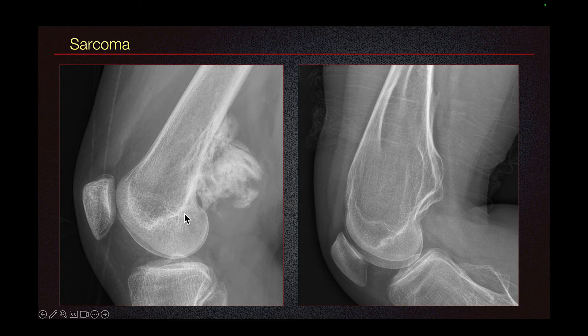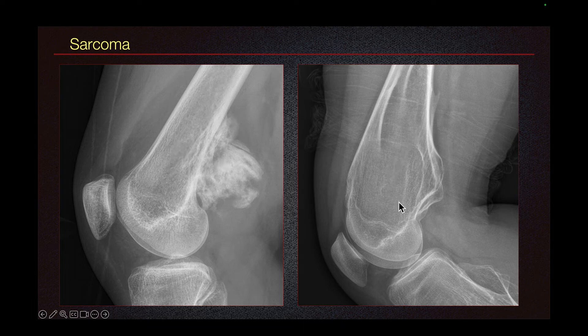Here on the left we have a case of a sarcoma — specifically a paraosteal osteosarcoma. We can see that the cortex and the medullary cavity is not continuous, as compared to the osteochondroma on the right.